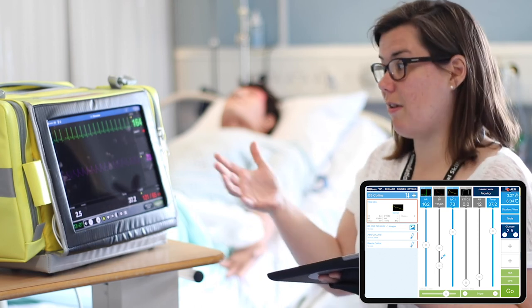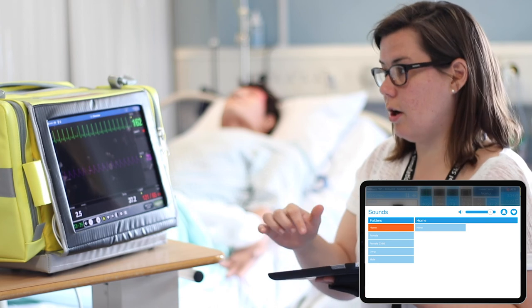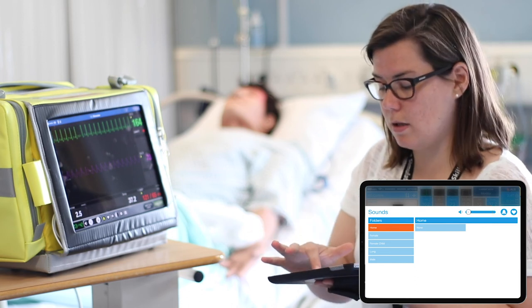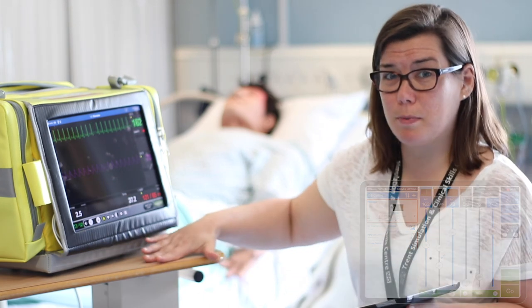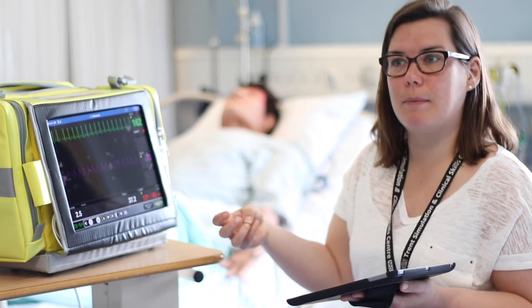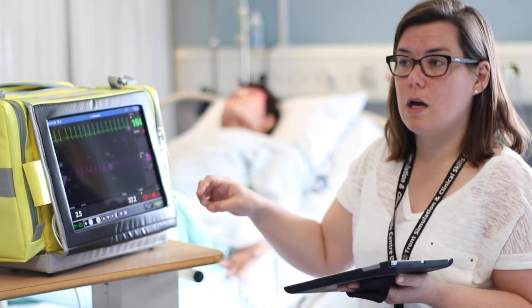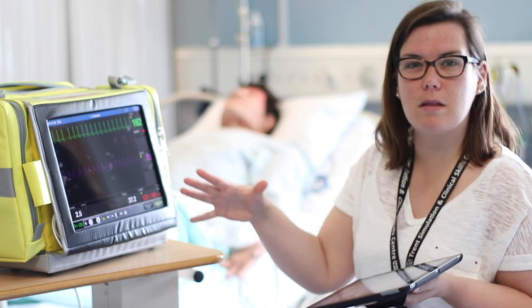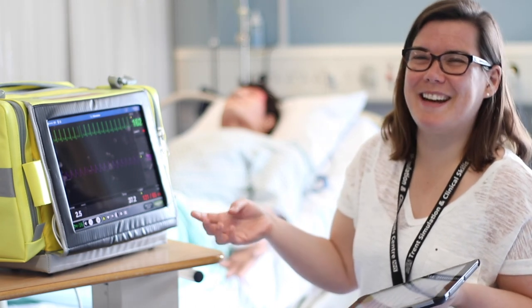Another feature we haven't used yet but think would be quite useful, especially if you've only got one facilitator, is marking. You can mark when certain events have happened — for example when they've attached monitoring, asked a specific question, or completed an investigation like an ABG or chest x-ray. That's really useful for collating information for your debriefing. As you'll see now, 30 seconds have passed, the monitoring has changed, and if we turn the sound back on you'll hear there's an alarm function very similar to normal clinical practice. To summarise: it's extremely portable, you can display observations and results all on one screen, the interface is really easy, and the only negative so far is the router connectivity.